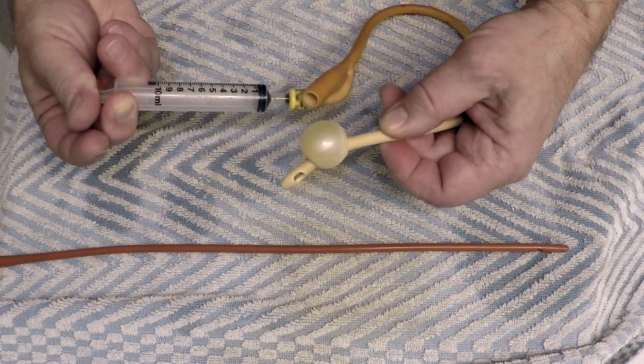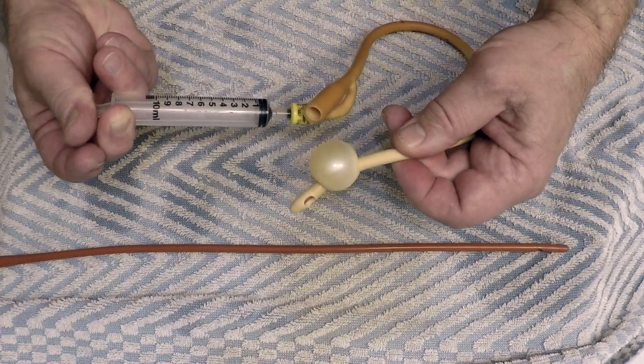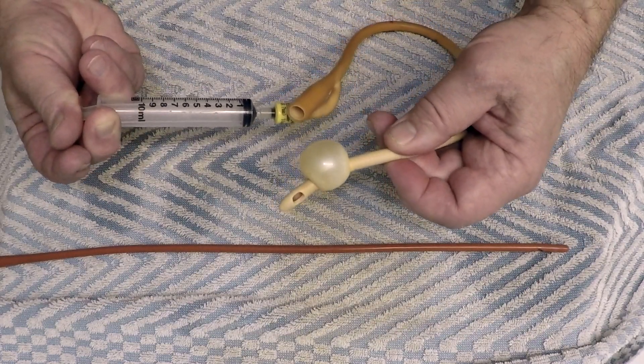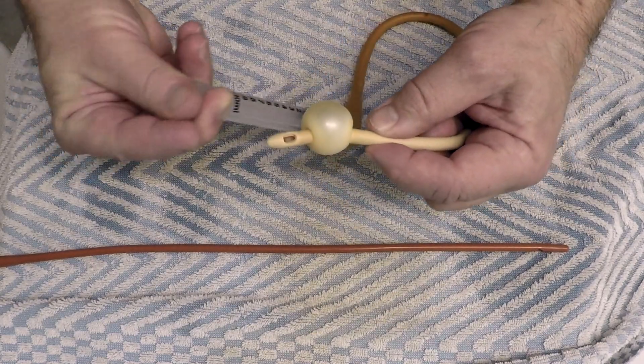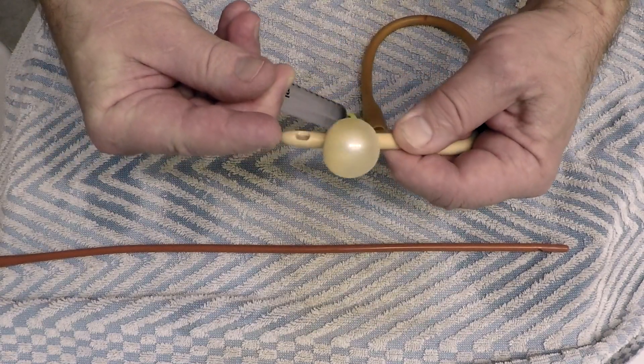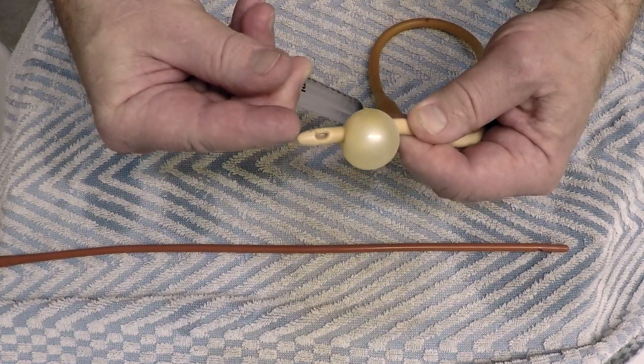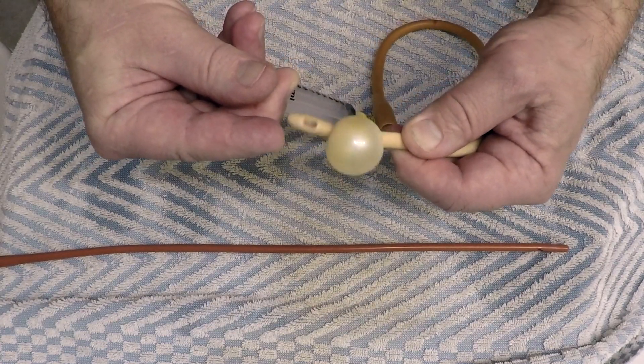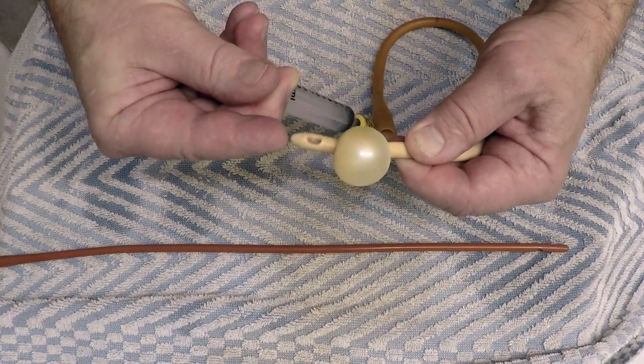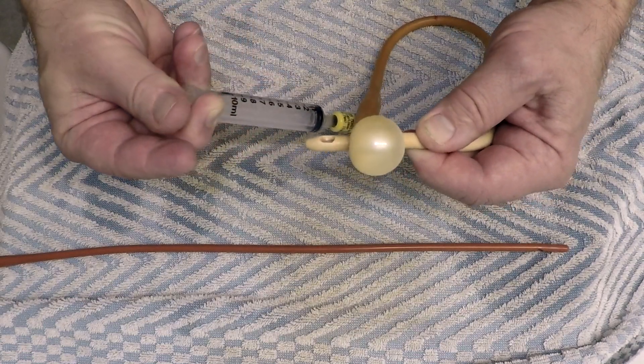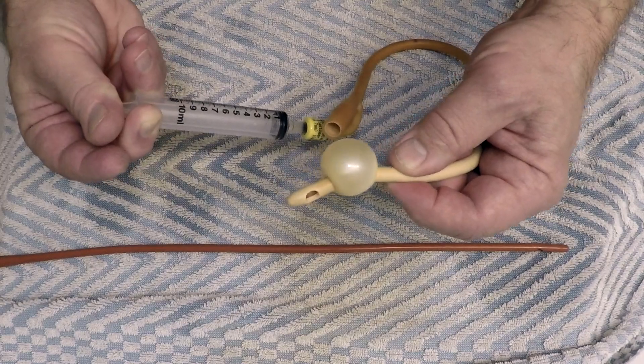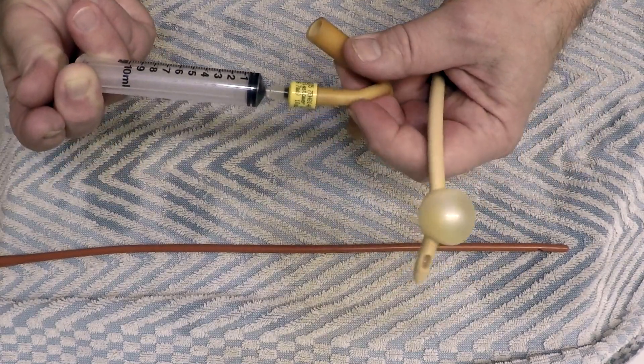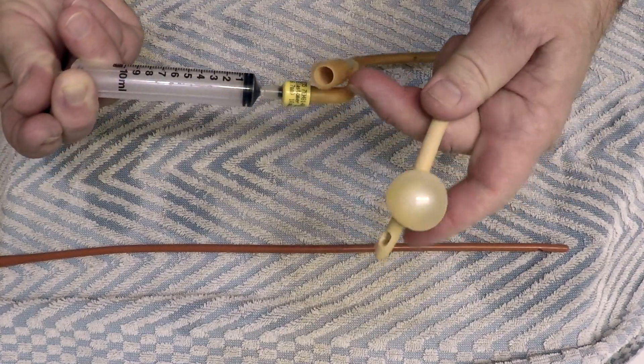So that's the little ball, that's the big ball. That was hopefully inside my bladder and then this little piece that was sticking up is further inside the bladder and it keeps it drained. The reason why I didn't just take a pair of scissors and cut here and drain it is because I wanted to see what this looked like.